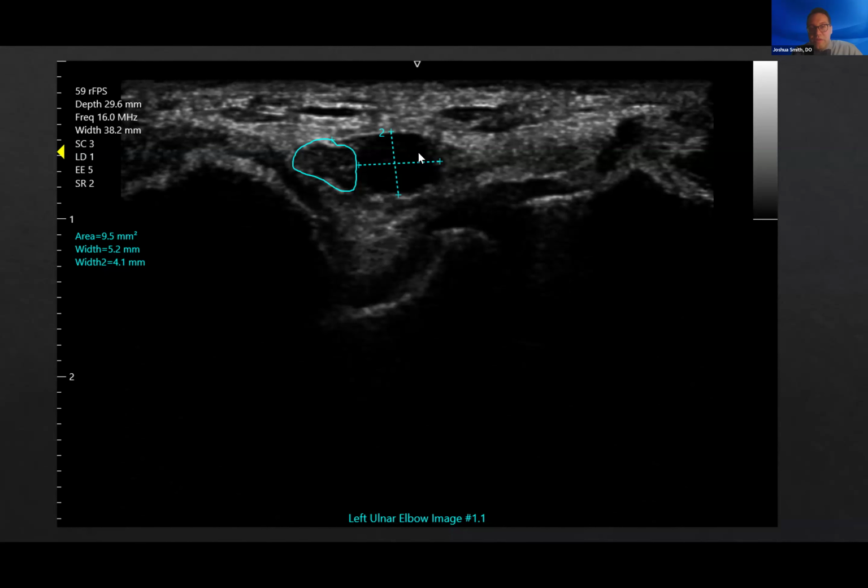For this patient, when you see this, this is really concerning for what's called an intraneural ganglion cyst. Probably what happened when this patient had their injury is you have an articular branch of your nerves that goes to your joints, but sometimes that synovial fluid dissects along it, and then it actually gets into the nerve and compresses it from the inside. So as many transpositions as this patient wants to get, unless they decompress this, cut it, drain it, and then ligate that articular branch, it's not going to take the pressure off.